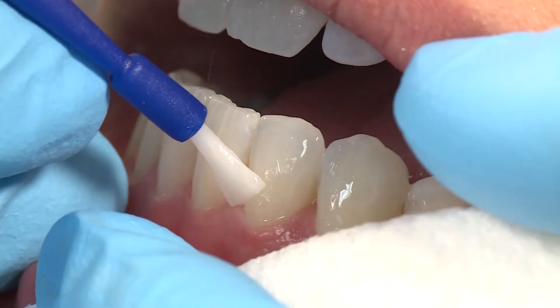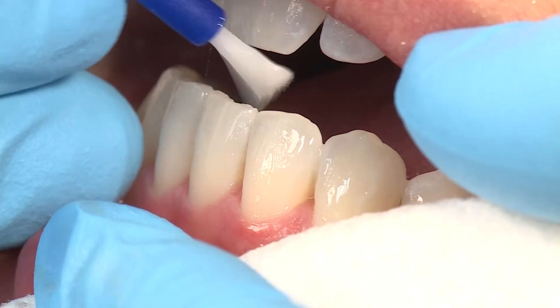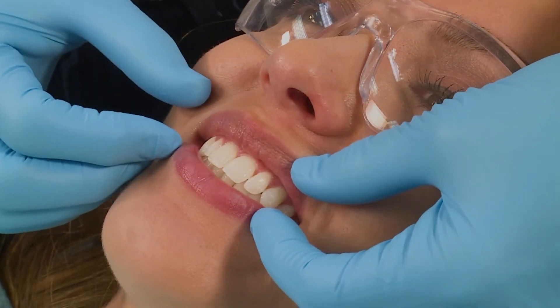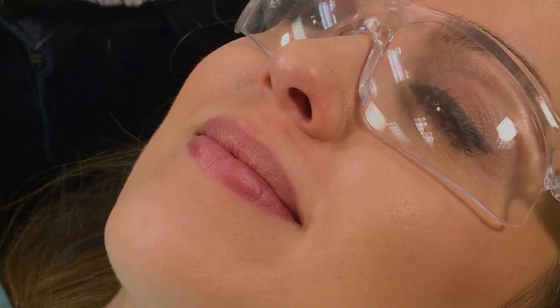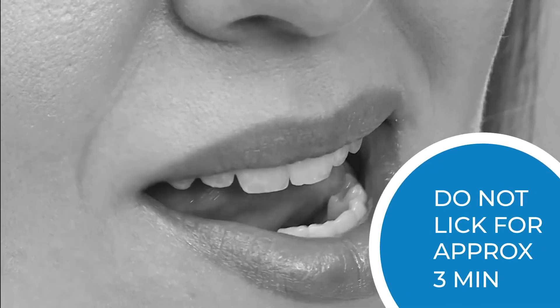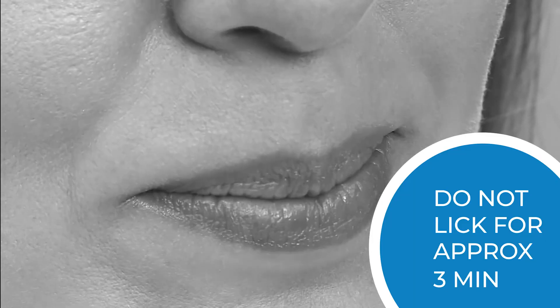Enamel Last Varnish sets when it contacts water or saliva. Allow cheeks, lips, and saliva to contact teeth, or gently flow cool water over the teeth. If aesthetics is a concern, encourage patients not to lick their teeth for a few minutes after placement.